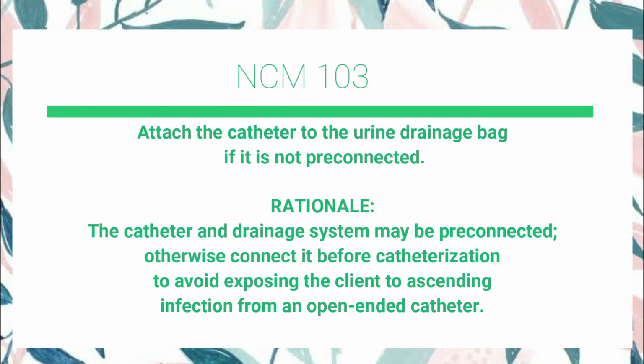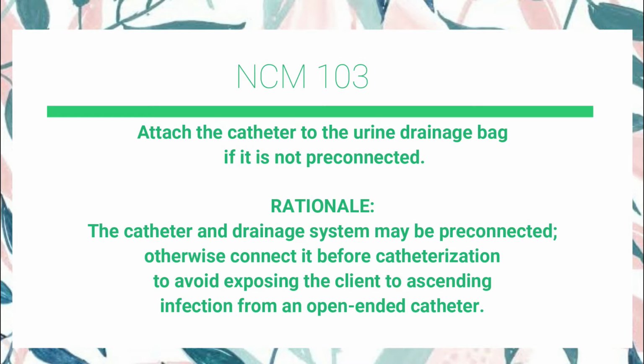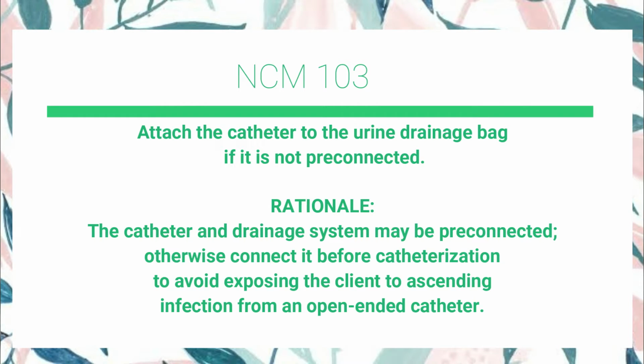Attach the catheter to the urine drainage bag if it is not pre-connected. The catheter and drainage system may be pre-connected. Otherwise, connect it before catheterization to avoid exposing the client to ascending infection from an open-ended catheter.